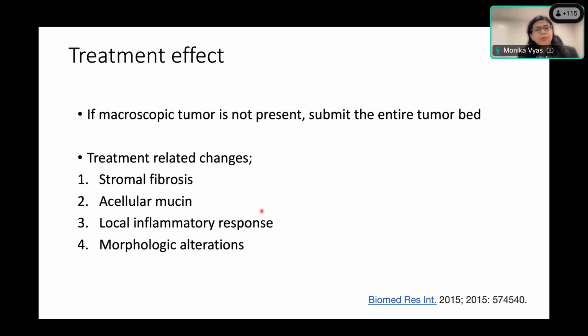And it's important to identify these treatment-related changes because it helps you identify the tumor bed, right? So when you don't see a microscopic tumor, it's difficult to know whether we have sampled the tumor bed or not. So especially for small tumors, that might be a consideration. So seeing these changes will help you understand that we did sample the right area, but we don't have residual tumor. And then obviously, these changes are also good to identify when you're doing a tumor regression score.